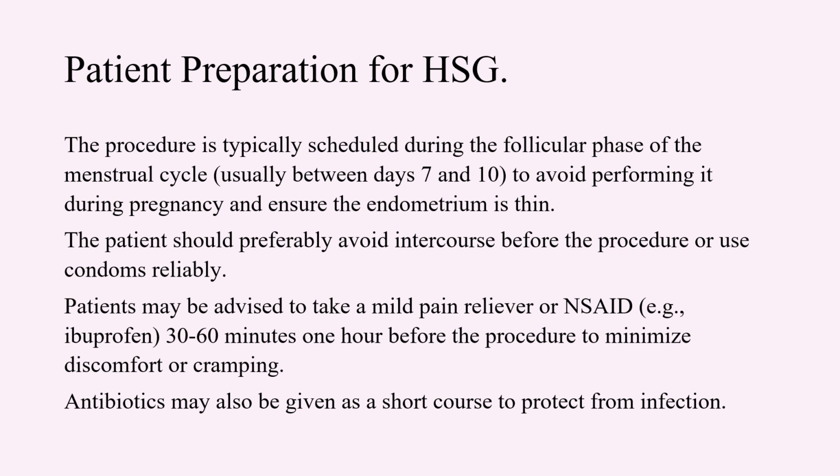The reason for performing it in the follicular phase is that we can avoid performing it during pregnancy, and also at this time the endometrium is thin, so the interpretation of the procedure and the static films or the fluoroscopy is very good. The patient should preferably avoid intercourse before the procedure, or she can use condoms reliably.